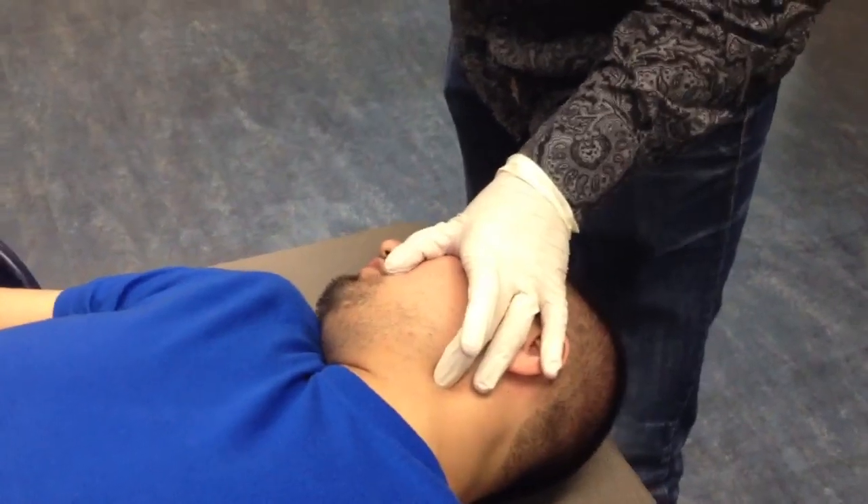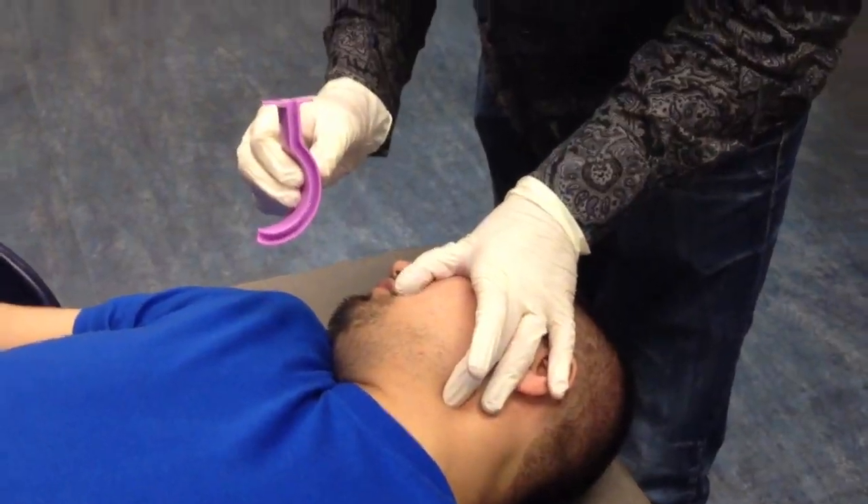When measuring an OPA, we're going to go from the corner of the jaw to the corner of their mouth using the curved part of the OPA. If you do not have the correct size OPA, you're going to use a larger one rather than a smaller one, as a smaller one may become an obstruction.